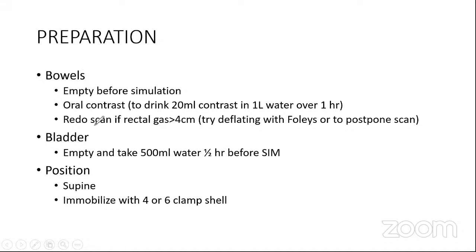Coming on to bowels, unlike the bladder, we cannot ensure reproducibility in the rectal distension. That's a bit of a difficult task. What we can ensure is to ask the patient to empty the bowels every time before coming to treatment, and to have a good representation, we would want to take the scan without rectal gas, because gas formation is again one feature which can vary a lot.